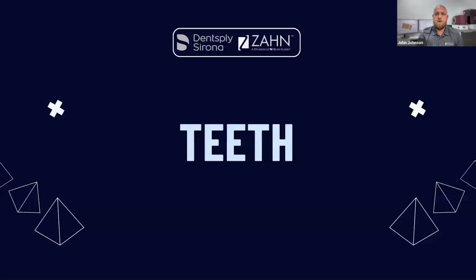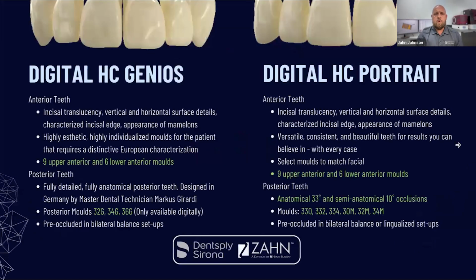Sorry. And let's go into the teeth. So when you get into your package of Dentsply Sirona, you're going to get the DMEs for the portrait molds, and you're also going to get the DMEs for the Genos molds. Now, those molds come with 9 upper anteriors, 6 lower anteriors, and then they hit on all the popular size posteriors.